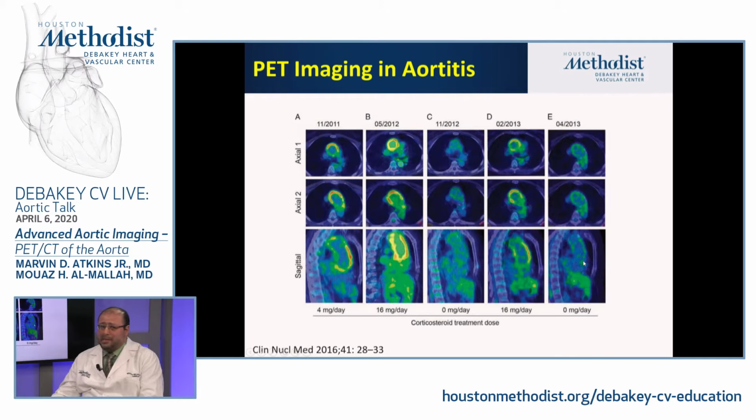So you can see certain examples like this, where we follow the same scheme, for example, in the heart for other inflammatory cardiomyopathies. Now we're taking it just outside the heart, same scheme, to the aorta. It will help guide your therapies. Is it safe to stop it? Is it safe to taper it? Are these symptoms coming from a flare or not? Especially if the patient is experiencing side effects from high doses of steroid therapy and others.